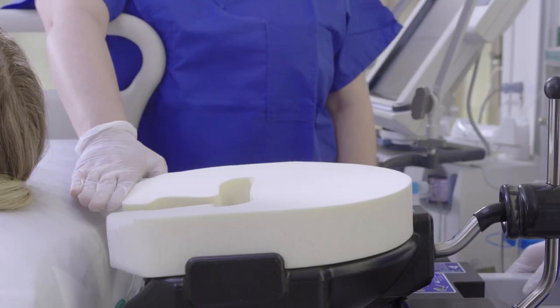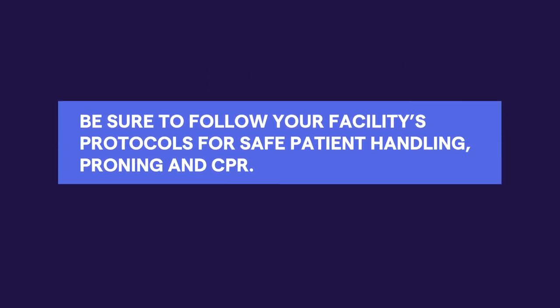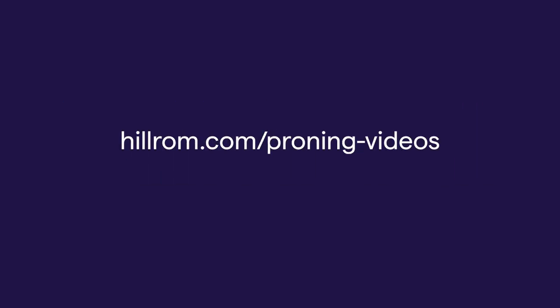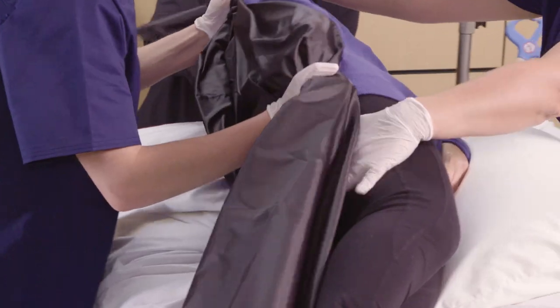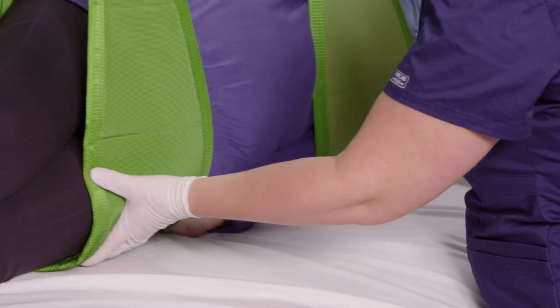The accessory is now attached to your bed frame and ready for use. Be sure to follow your facility's protocols for patient handling, proning, and CPR if necessary. For information on proning techniques, visit hillrom.com/proning-videos. There you'll find educational videos on how to safely manually prone patients or prone patients using safe patient handling equipment.